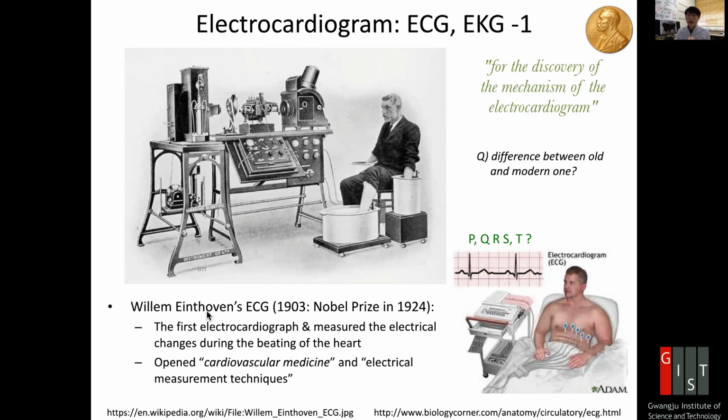He's Dutch and he's a doctor, and he was the one who first created this device to measure the electrical changes during the beating of the heart. So he's the father of cardiovascular medicine and of electrical measurement techniques. For this discovery of the mechanism of the electrocardiogram, he was awarded the Nobel Prize in 1924.